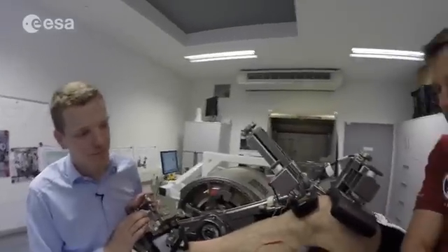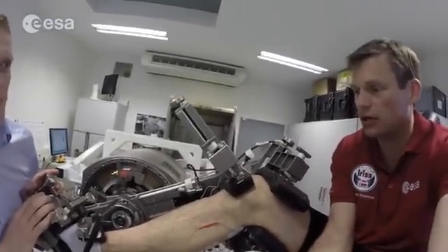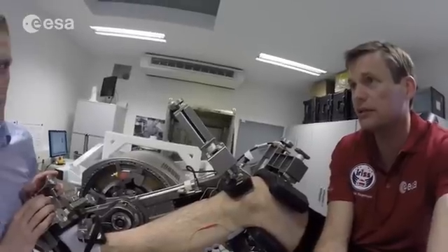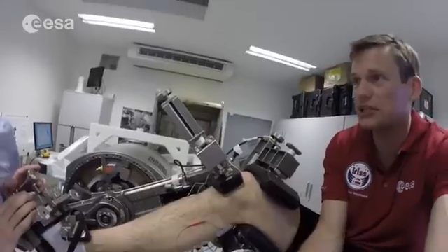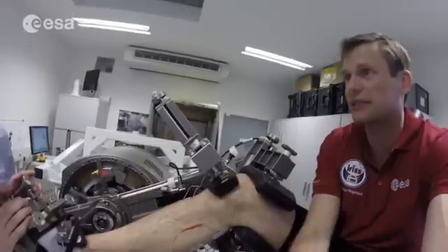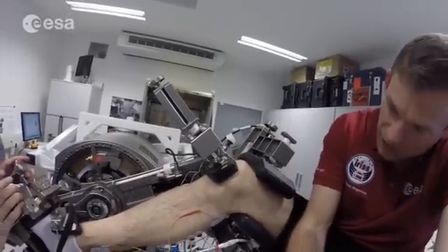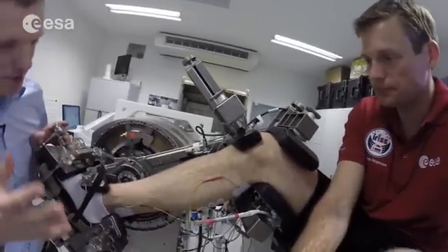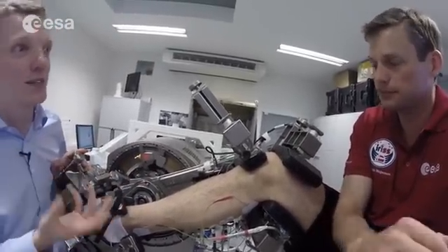And we'll be able to distinguish between them by me doing exercises on this and recording the torque values, and then at the same time applying electrical stimulation to see if the muscle is capable of more than I'm actually asking of it. Is that right? That's perfectly summarized. So that's important to distinguish what your muscle is capable of and what your brain is capable to ask of your muscle.